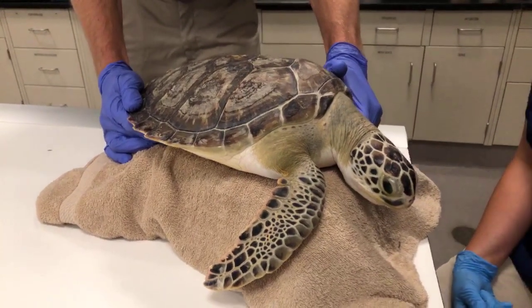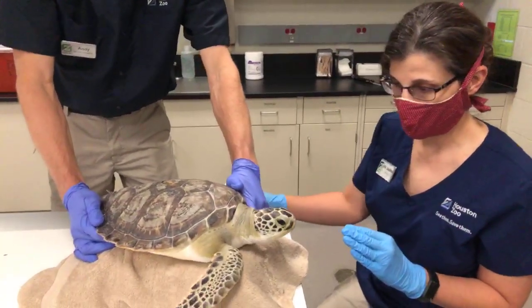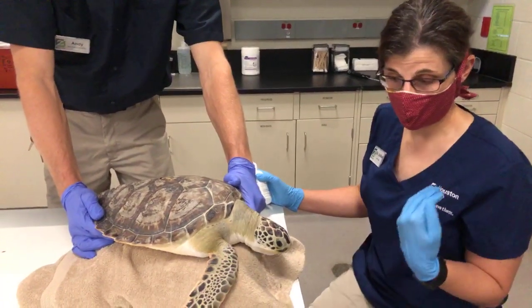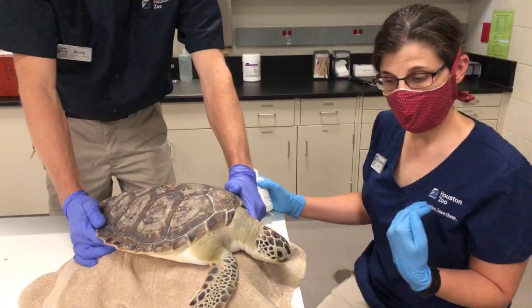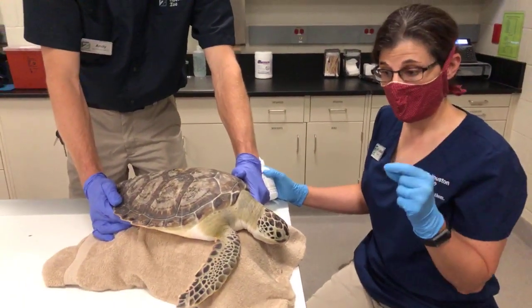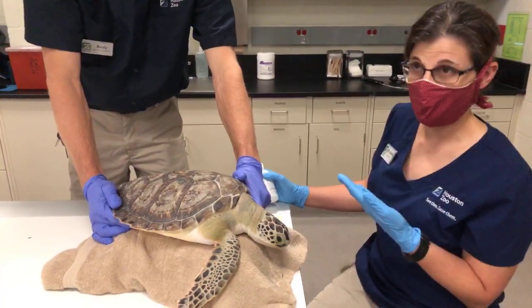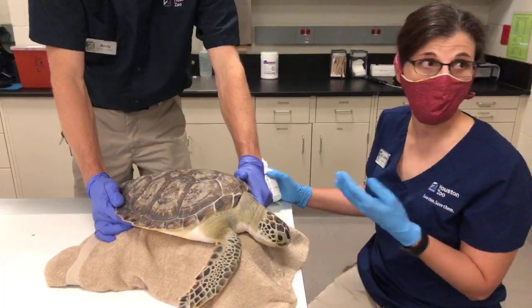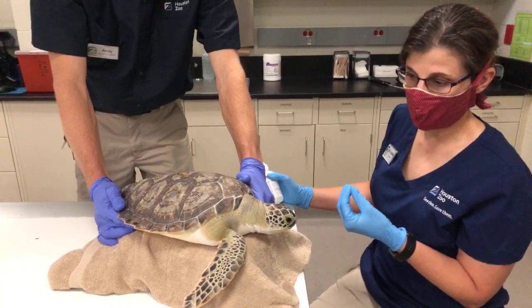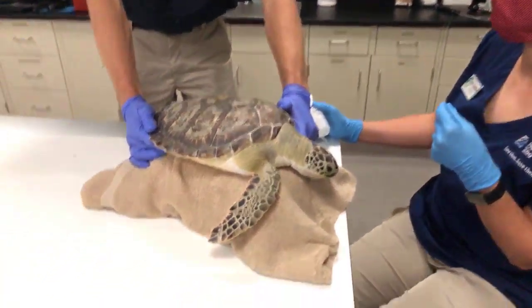So Dr. Joe, we're not seeing anything on the eye exam, no stain uptake, so no ulceration of the eyes, no issues with increased intraocular pressure, and we're not seeing any outside abnormalities. These guys have very, very tiny pupils. They're meant to see in deep, dark waters, and so in normal light like we have here, even though we've turned the lights down a bit, it can be hard to see all the way into the back of the eye. So if we're going to look at that at a later date, we would probably have to dilate the eye in order to look at the back of the retina.